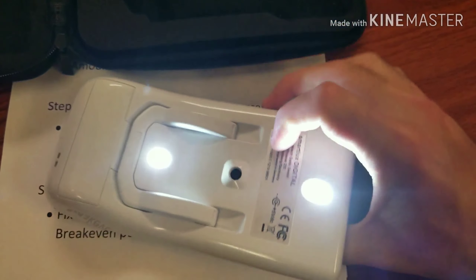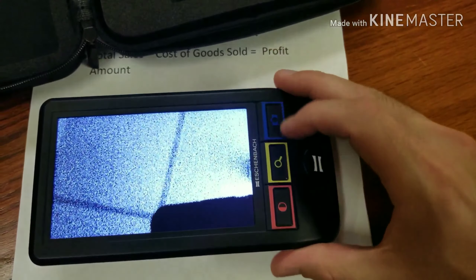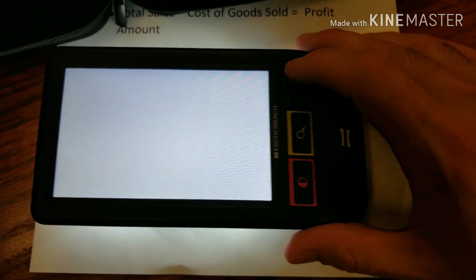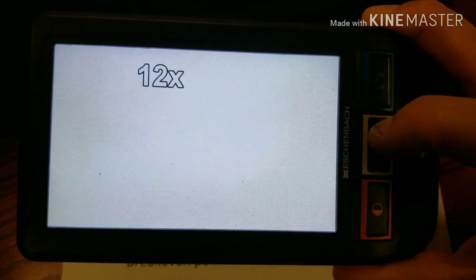Power on the device and you're immediately presented with its default zoom setting. It's got this little leg stand right here so that you can read or take a picture — screenshot something you want, pull it up, and zoom in. It's not really going to come in too well on camera, but the middle button is to zoom in.